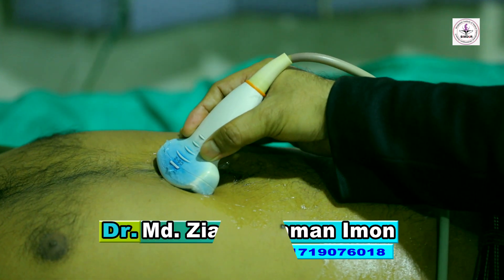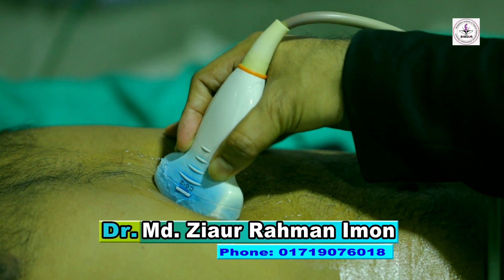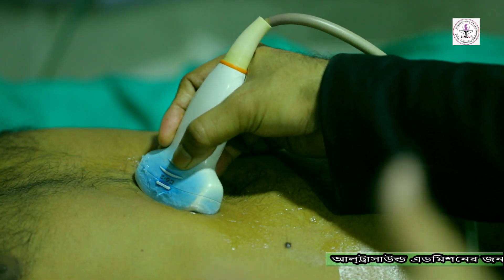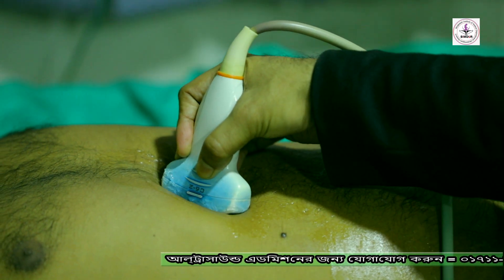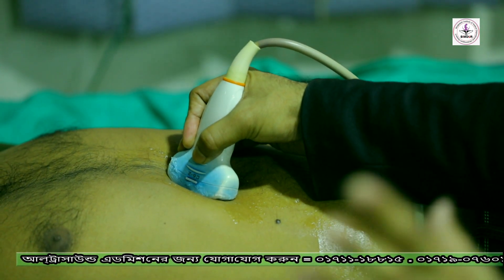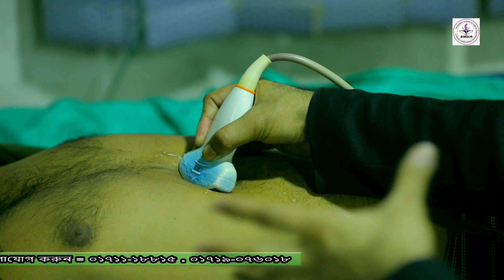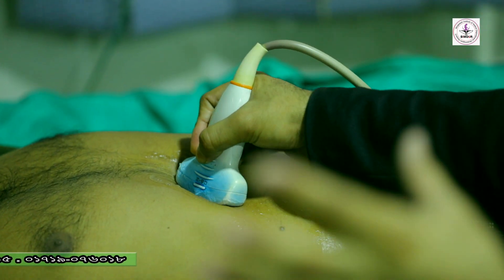For gallbladder visualization, your probe direction should always be sagittal oblique at 45 degrees — this is the main position. Otherwise you cannot visualize the gallbladder easily. The gallbladder always shows clearly with sagittal oblique at a 45-degree angle. This is the importance of probe direction. Patient inspiration holding is also very important for proper visualization.